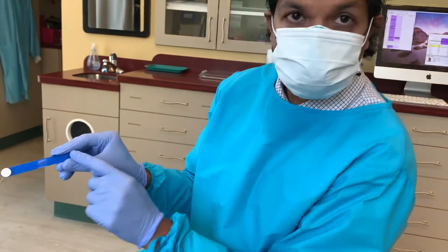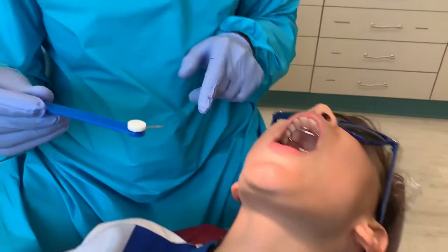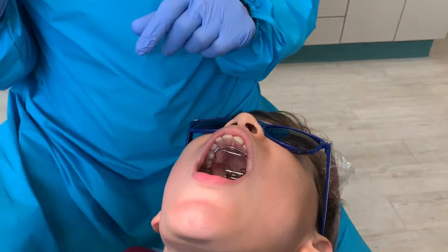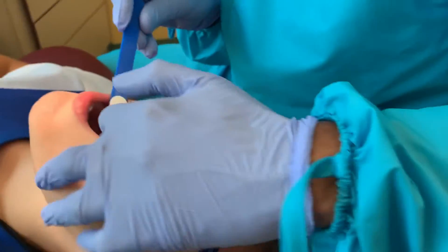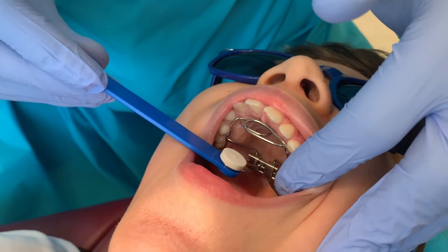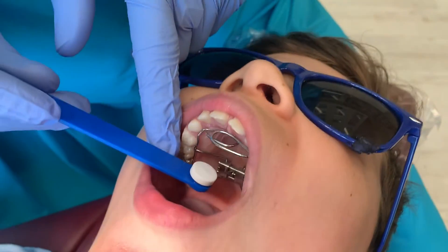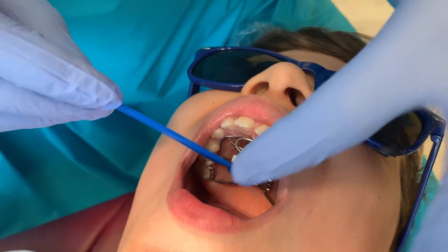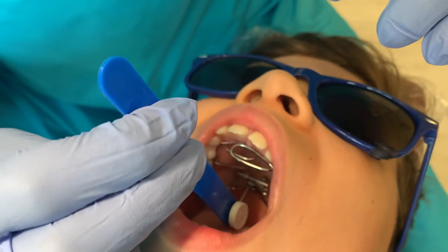You want to hold the key at the end — the RPE key. You don't want to come perpendicular or parallel to the roof of the mouth; you've got to come at a 45-degree angle. There is a hole right there — there are three lines, and the one in the middle has the hole. You come towards the hole, take your left pointer finger and push it inside. Once it's in, you turn it this way and push it backward.